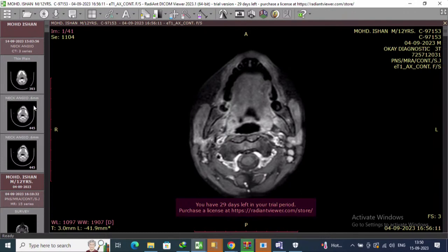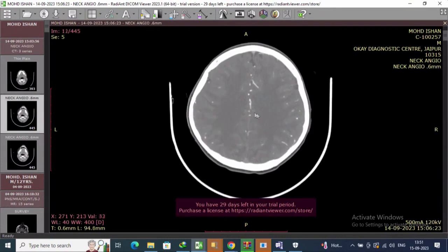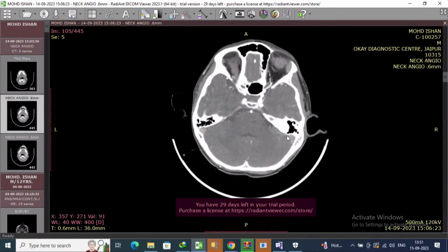Are we audible? Yeah. Just a minute. So, are you getting a scan on the screen? Yes, sir. We're getting the scans. The case is getting ready.